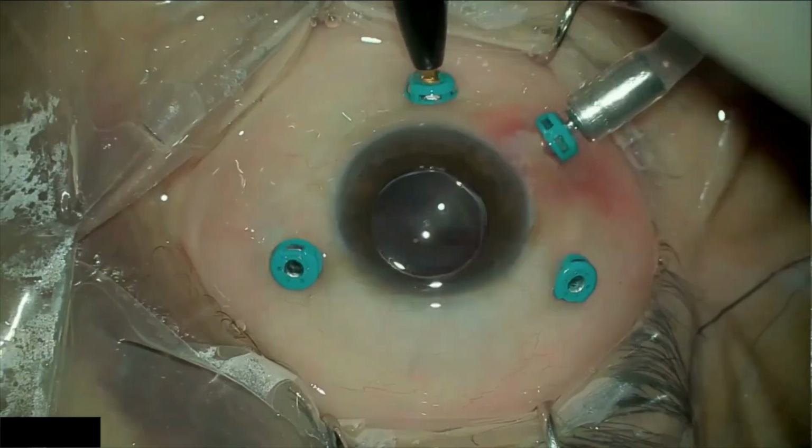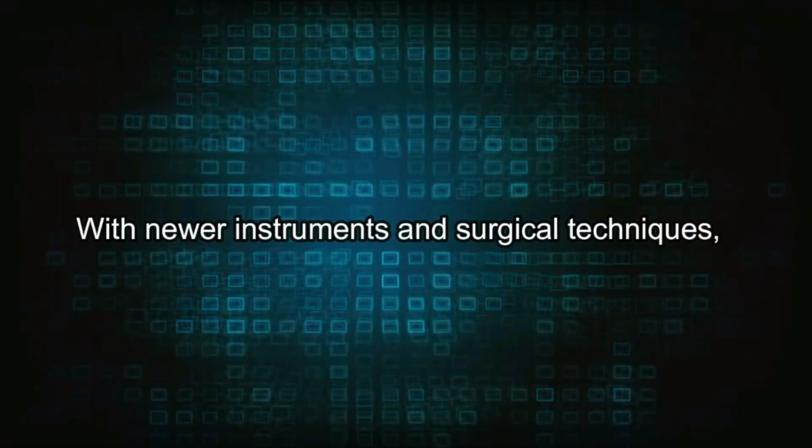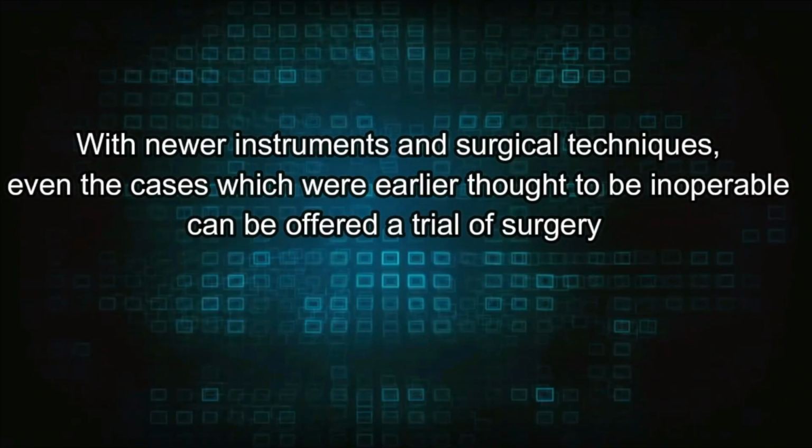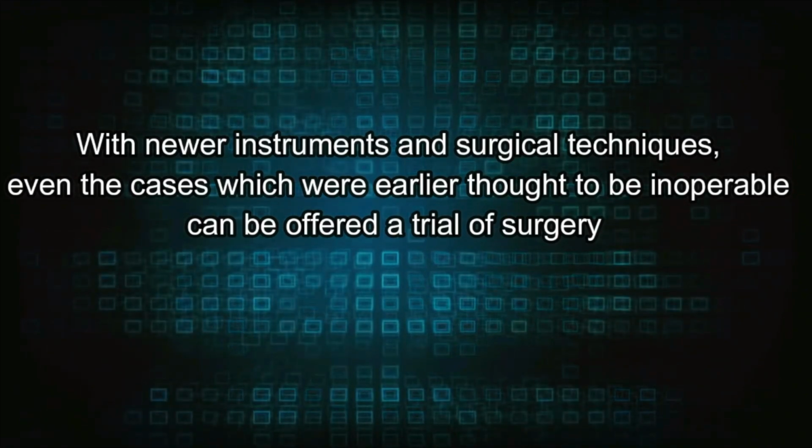Chandelier-assisted bimanual surgery is done in cases of adherent membranes where intravitreal forceps and scissors both are used for segmentation and delamination. With newer instruments and surgical techniques, the cases which were earlier thought to be inoperable can now be offered a trial at the surgery.